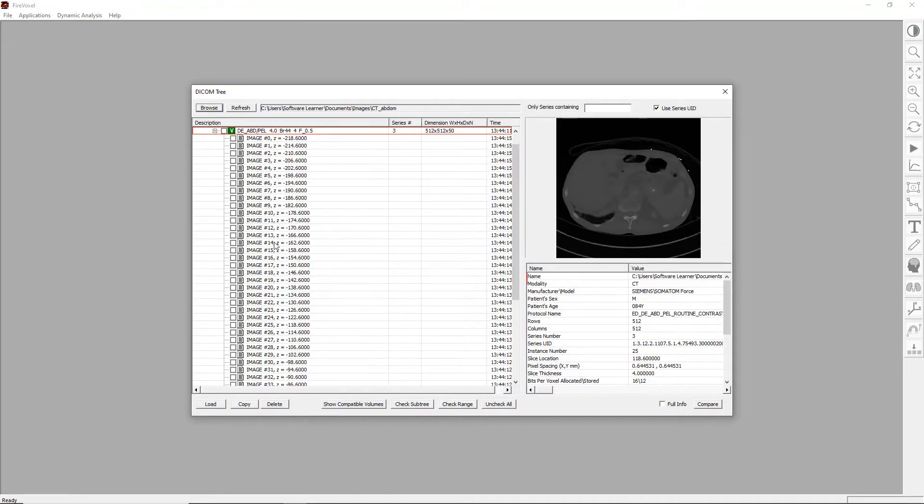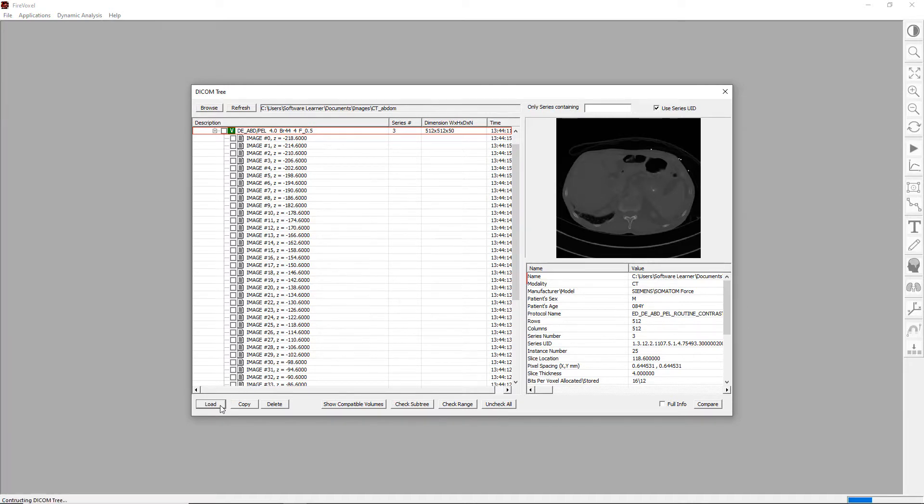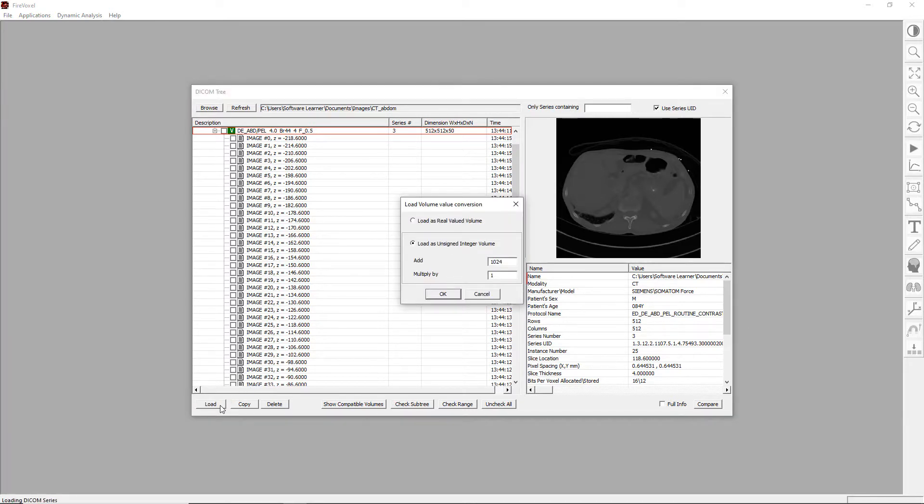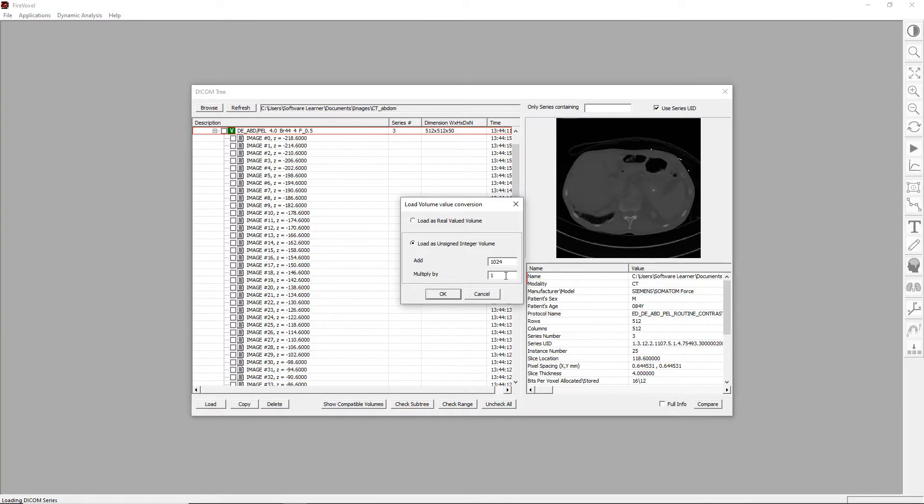Here we have a list of abdominal CT images. Let's click Load. Next, we'll confirm the value conversion from the CT Hounsfield units to grayscale values. This linear transformation has the slope of 1 and the intercept of 1024.